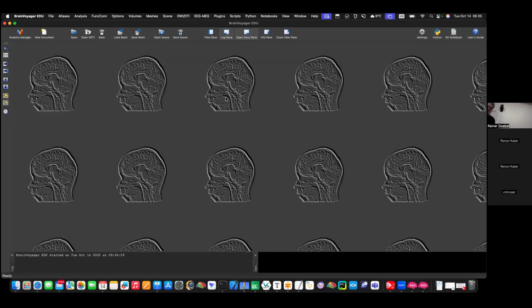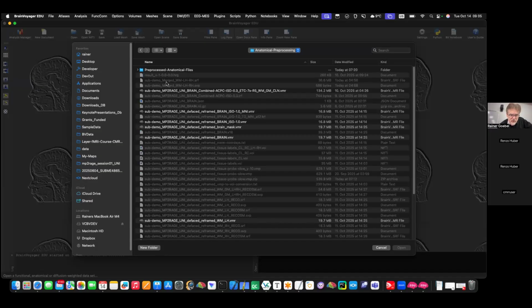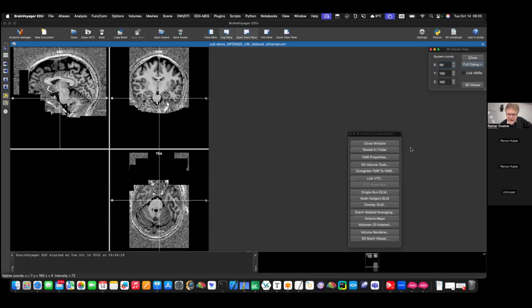But first I want to show you that you can now follow along on my computer, because you can keep the file which you have loaded. Let me just go to the same file, because I opened the second version now. Basically, open the same file you have open, this one here. Now if you go to this panel here, there is something called volume maps.